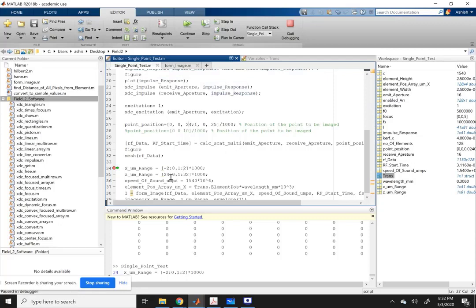We can actually change it a little bit earlier than this 24 point, because we are trying to look at these 2 points which are located at 24 millimeters and 25 millimeters away. So we need to reconstruct a little bit earlier than that, say 23 millimeters to 32 millimeters.